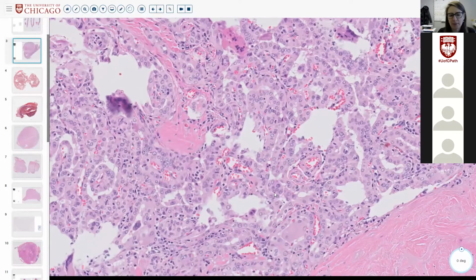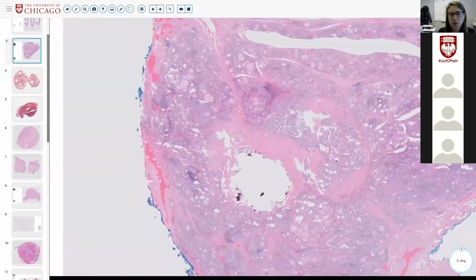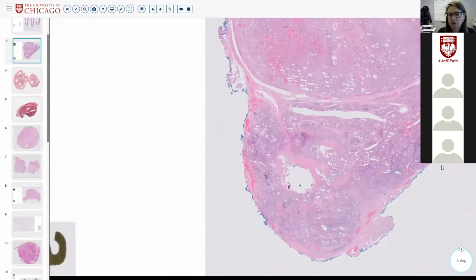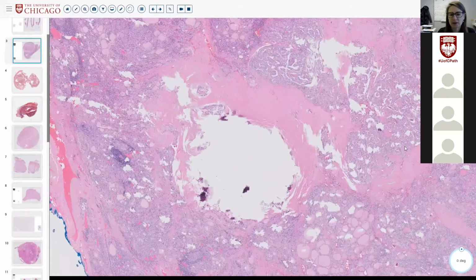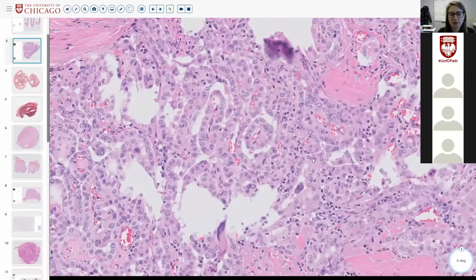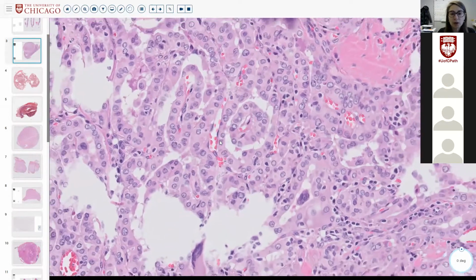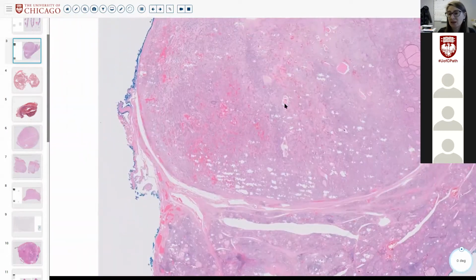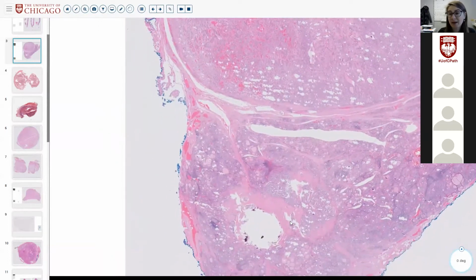All right, so this was just an example of how the thing they were going after ended up being essentially a benign, adenomatous NIFTP kind of nodule. There's chronic thyroiditis in the background, but don't forget to look out for incidental microcarcinomas. If you have an incidental microcarcinoma, you can compare what you see in it to what you see in the lesion of interest, and it sometimes may help you say, oh, this is completely different. I feel good about my diagnosis. This carcinoma is obviously not that, so I feel comfortable calling this basically benign. Does that make sense? Okay.